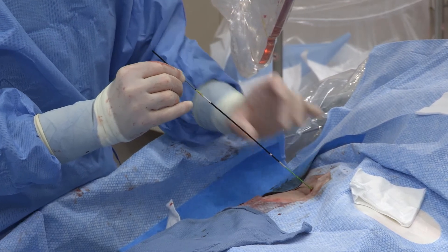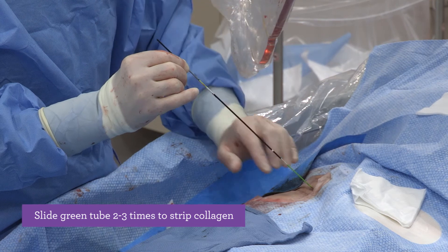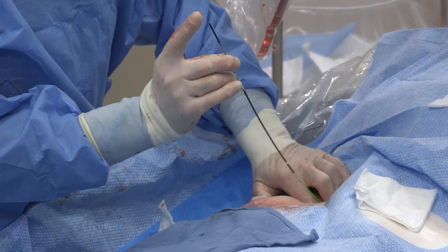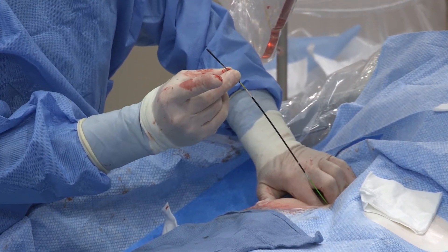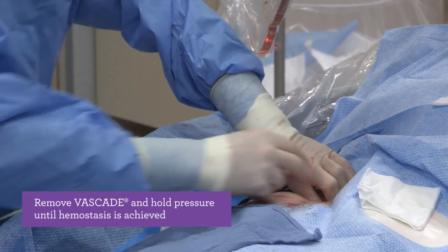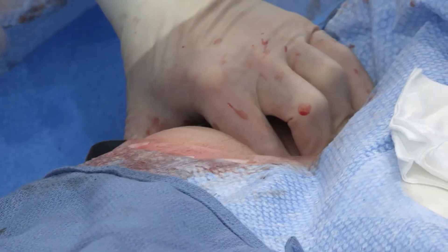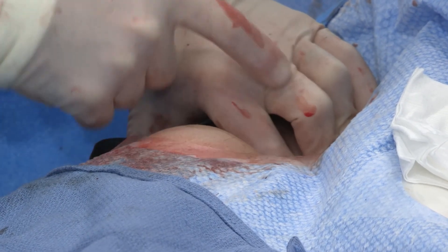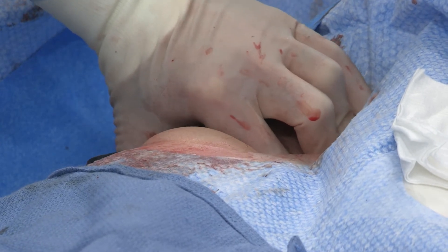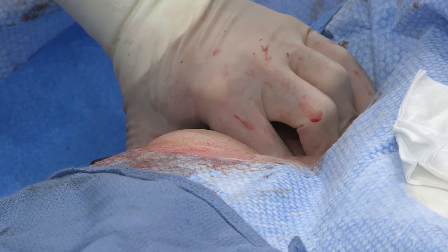Now we are coming to the 15 seconds. At around 60 degrees, I hold it, bring my green tube, and push the collagen on top of the artery. It's very important to hold correctly — two fingers above, one finger below, feeling the pulse. I hold the silver handle with my middle finger and thumb, close with the index finger, remove the sheath, and hold pressure. Using three fingers, I hold the artery with the tips of my fingers, anchoring the collagen in place. We hold about three minutes for patients who are not anticoagulated, and five minutes for those who are — or simply hold everyone around five minutes. The procedure is now concluded. Thank you very much.